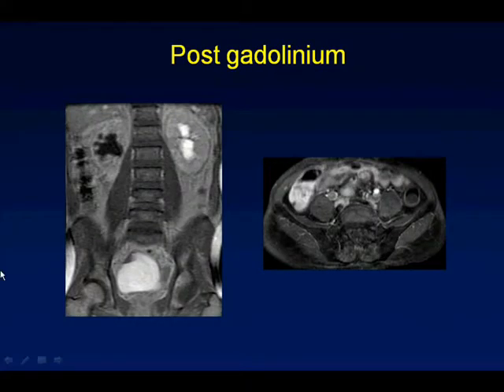Okay, and just post-contrast for completeness, you can see that there's chronic obstruction on the right side, there's lack of contrast filling the collecting system, so you know this is pretty high-grade chronic obstruction, whereas on the left side, even though you have hydro, you still see some contrast in the collecting system. And post-contrast showing that there's filling defects within the ureter on the right side.